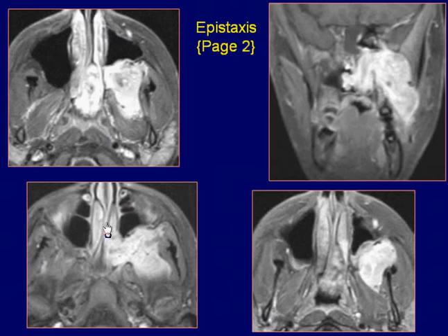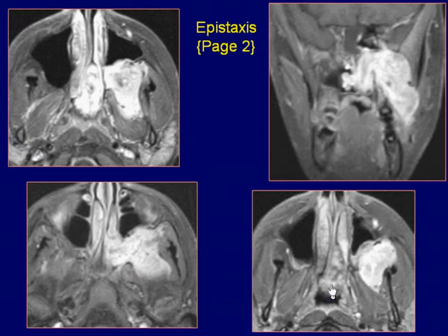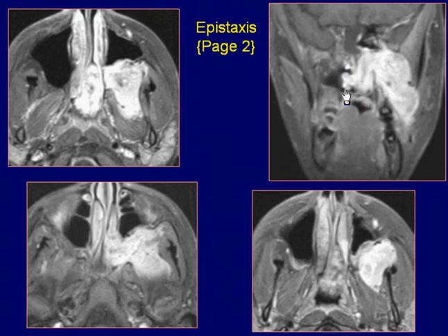Axial post-gadolinium fat saturation T1-weighted images show the lesion is intensely enhanced with contrast. Coronal post-gadolinium fat saturation T1-weighted image demonstrates the enhancing lesion that involves the left masticator space, pterygopalatine fossa, and posterior nasal cavity. The low signal seen within the right sphenoid sinus is likely due to fluid related to obstruction of the sinus opening by the lesion.